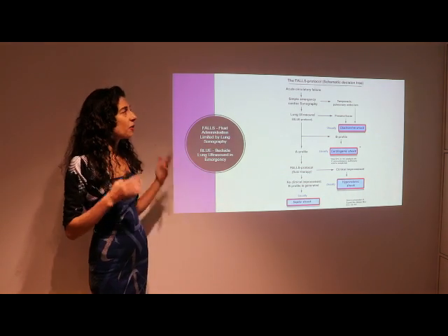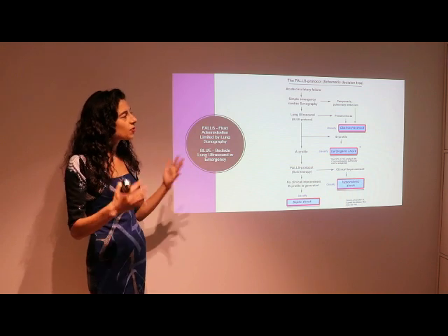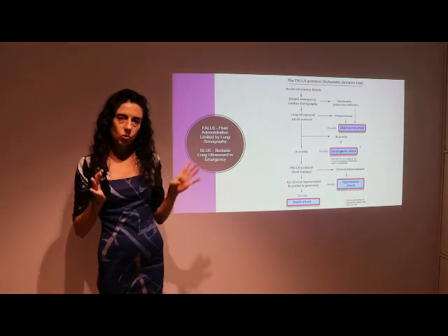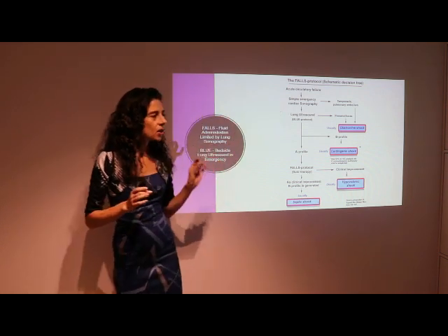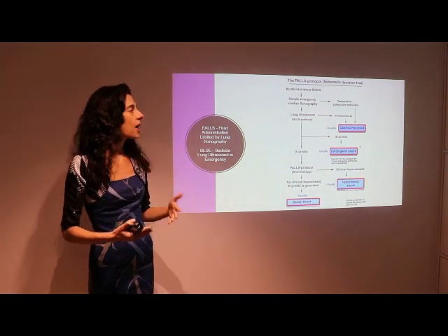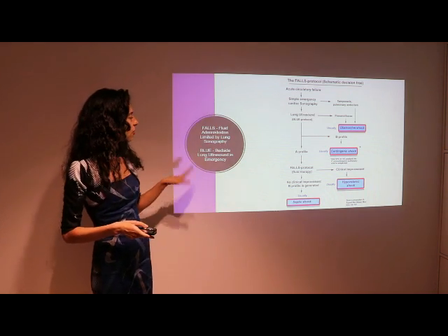And dear colleagues, another very useful application of point of care ultrasound and lung ultrasound is in the differentiation of different kinds of shock in patients presenting with acute circulatory failure. So the first thing to do is a simple emergency cardiac sonography, as you see here. Then you could rule out or rule in a tamponade or pulmonary embolism, which could be the cause of an obstructive shock.